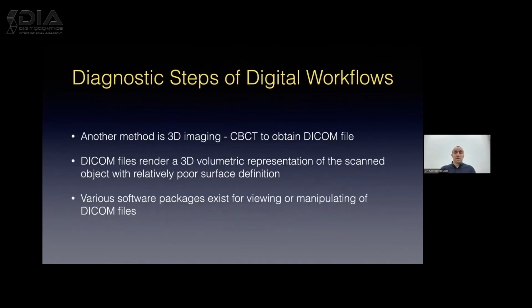Another method is 3D imaging, which is CBCT, to obtain a DICOM file. DICOM files render a 3D volumetric representation of the scanned object with a relatively poor surface definition. Various software packages exist for viewing or manipulating DICOM files.